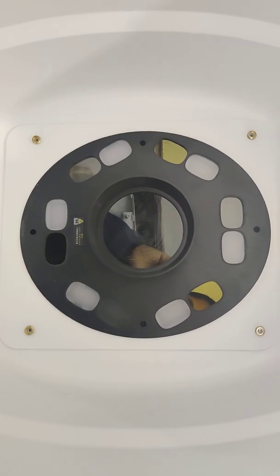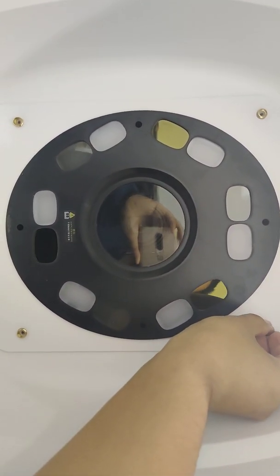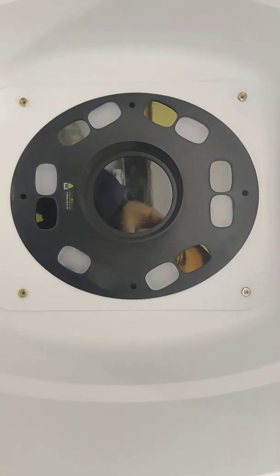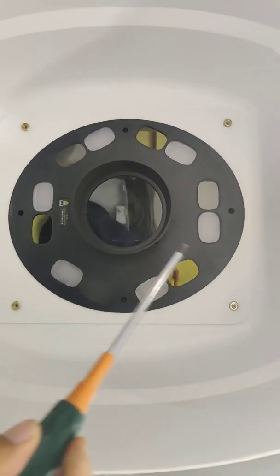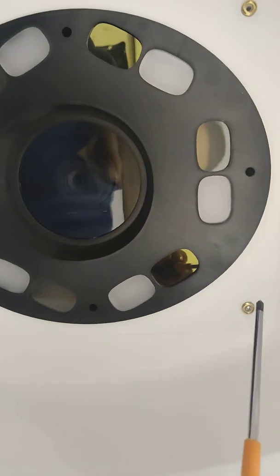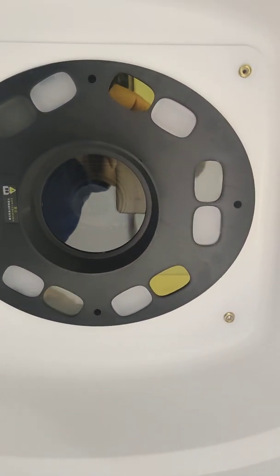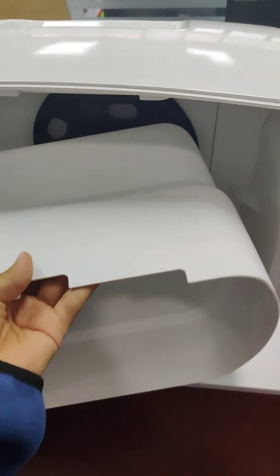We just spin it off. Okay. Then we can use the screwdriver to take off the screws. 1, 2, 3, 4. Okay, when we take off all the screws, we can take off this board.